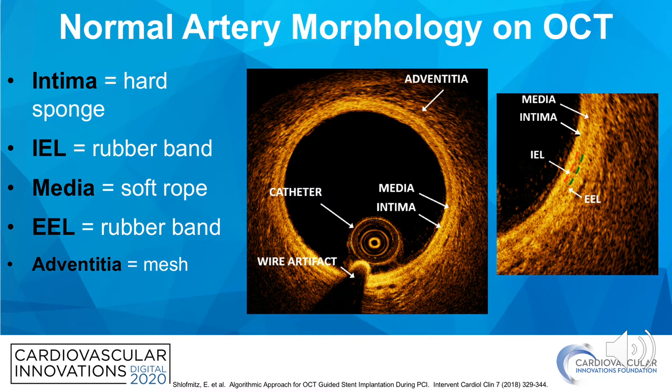Now that you've acquired an image, next up is interpreting the image. Here we have an OCT cross-section of a normal coronary artery. We have the catheter which runs along the guide wire, and there's always guide wire artifact shadowing alongside the catheter. Due to the high quality resolution of an OCT catheter, we're able to see the three distinct layers of a coronary artery wall: the intima as labeled, the media with its inner elastic lamina and the outer external elastic lamina, and lastly the adventitia.